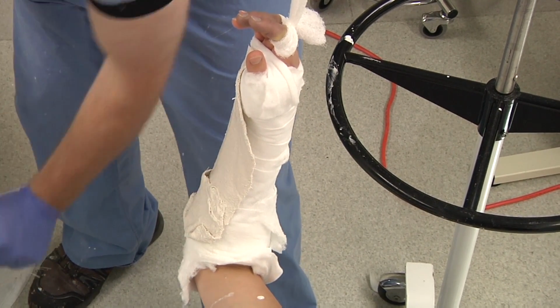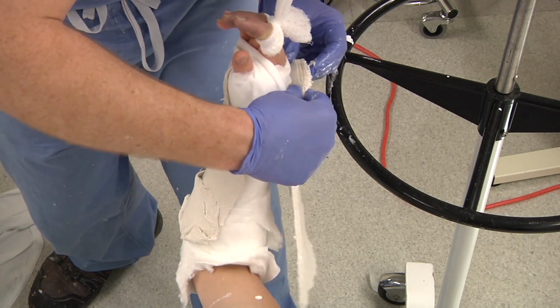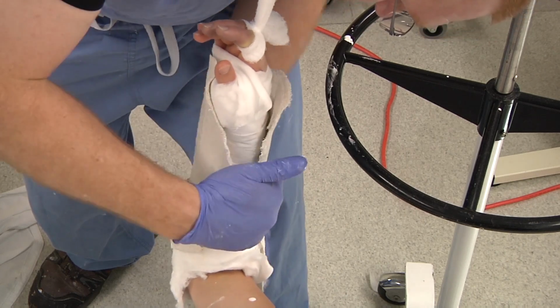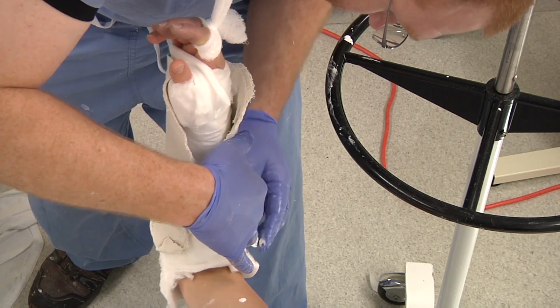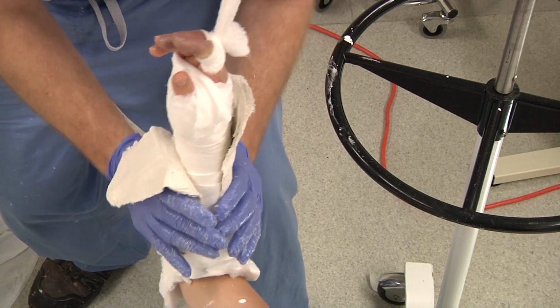Generally, try to do the volar slab first, and then the dorsal slab, though it doesn't really matter. Make sure you end at the level of the metacarpal heads on the dorsal aspect. If you need to bend it back, cut it. Just make sure you're not leaving any sharp angles.